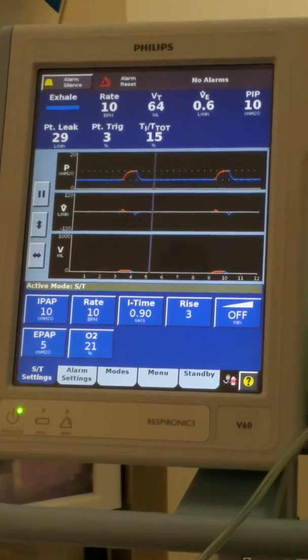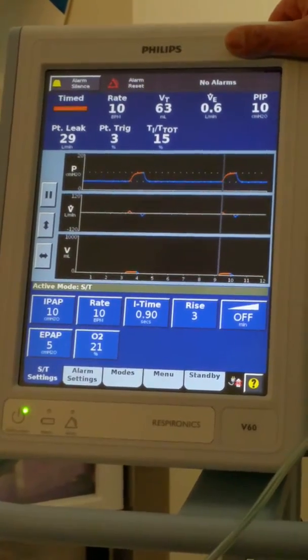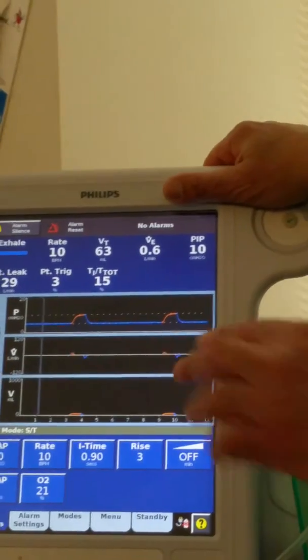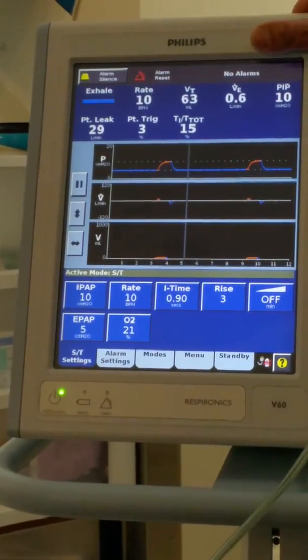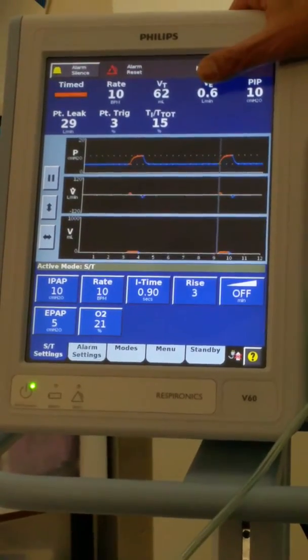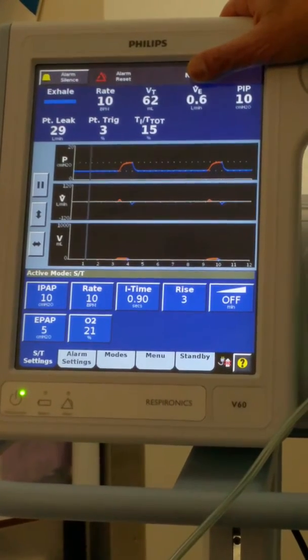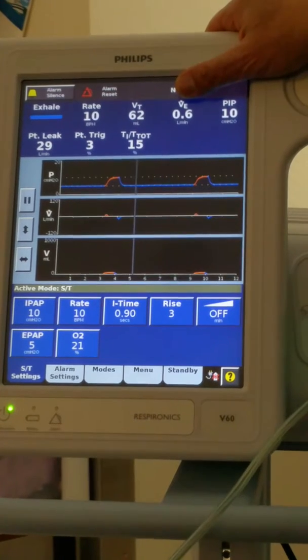They'll be on higher FiO2s, because one reason they'll buy one of these machines is hypoxemia. So how are you going to adjust that? What's going to make you want to change the FiO2 in the real world? If they need more oxygen. Saturation. Yeah, you're going to be watching their SAT.